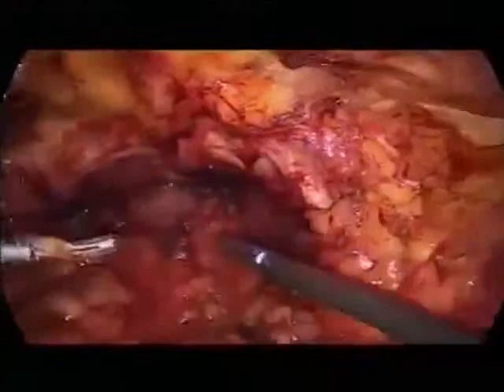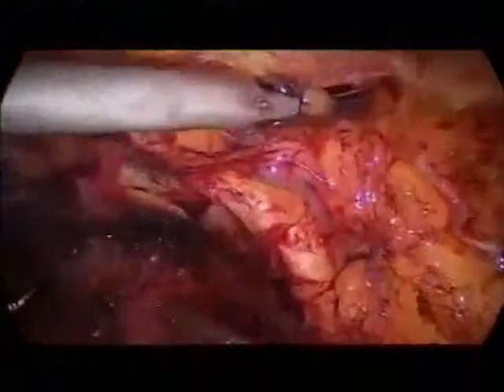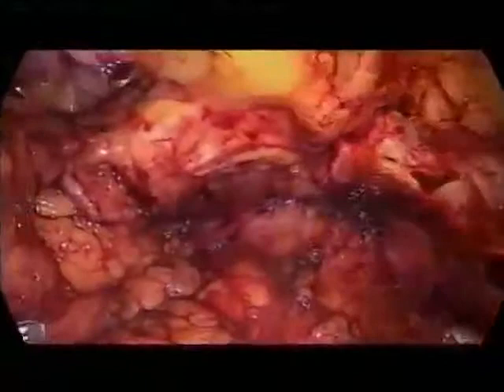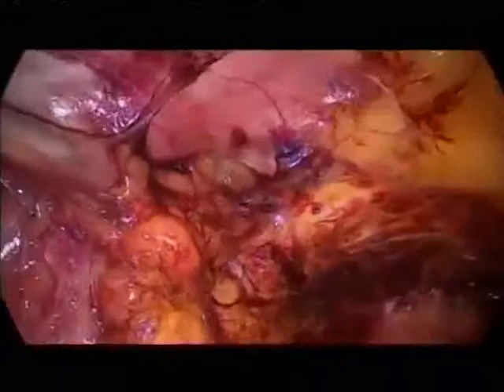Would you place a mesh in? No. The patient has no symptoms. This is not really a defect. It's just not as strong as it usually is. So we would not place a mesh now. But if the patient would have a hernia defect, we would place a mesh at the end of the procedure. And this is in about 4 to 6% of our patients.